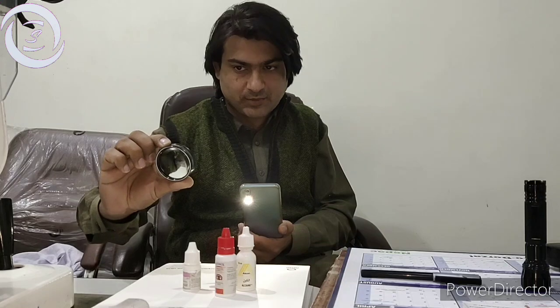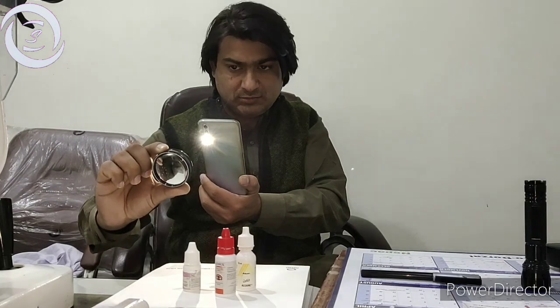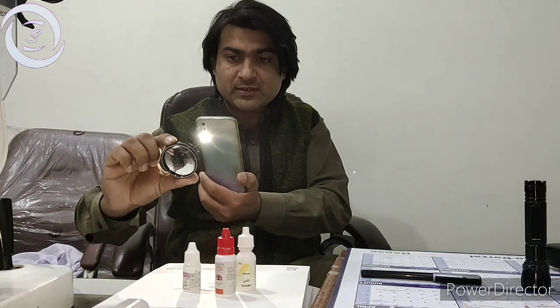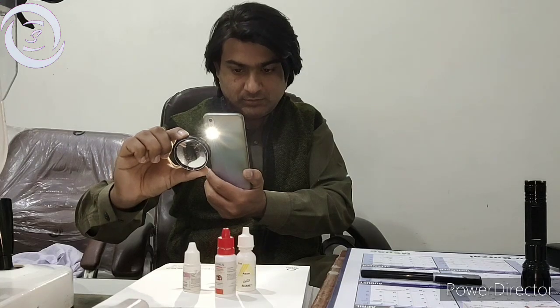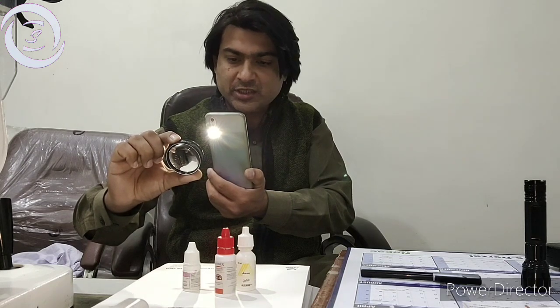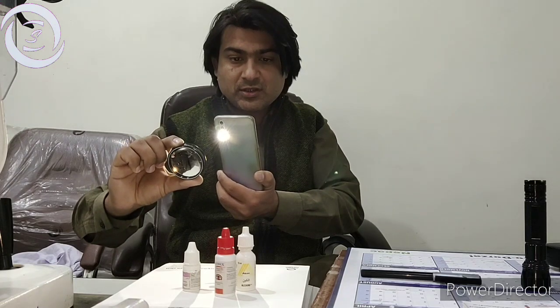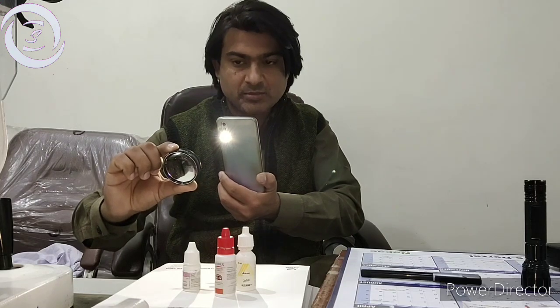The lens should be in your dominant hand because you have to focus the fundus. Tell the patient to look straight ahead and not to move the eye. Then slowly and gradually move the lens, and with the flash on, you will be able to see the orange glow of the fundus. If you have used the 20 diopter lens before, you will know the exact position where to keep the lens. Then press the recording button.